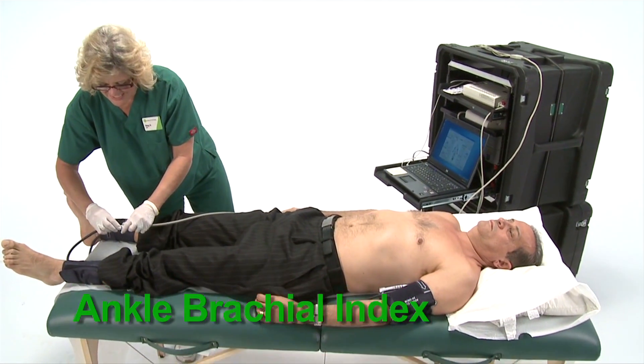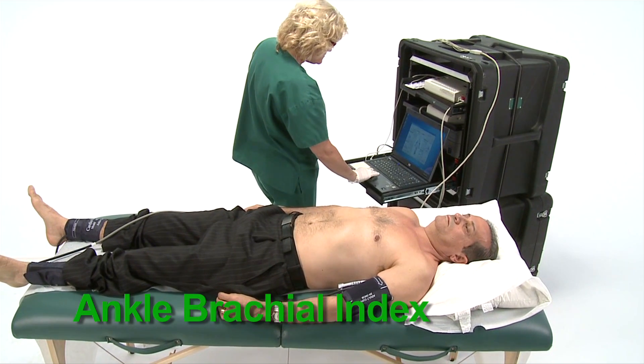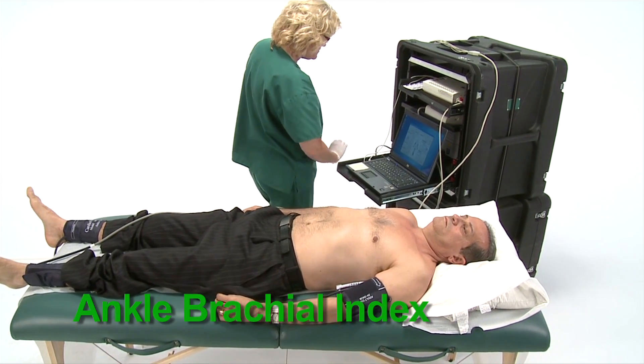The Ankle Brachial Index Test is a quick, non-invasive way to check your risk for peripheral artery disease, or PAD.